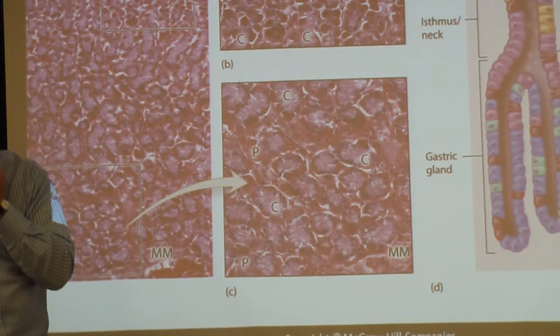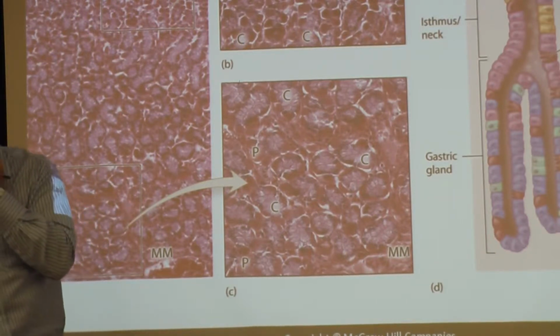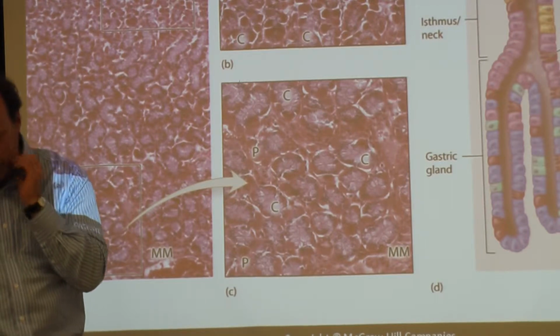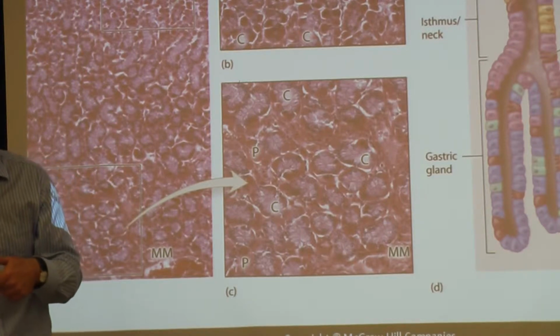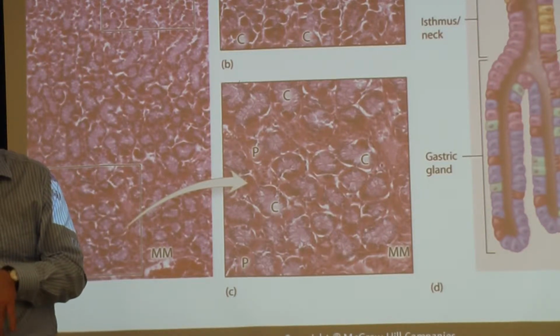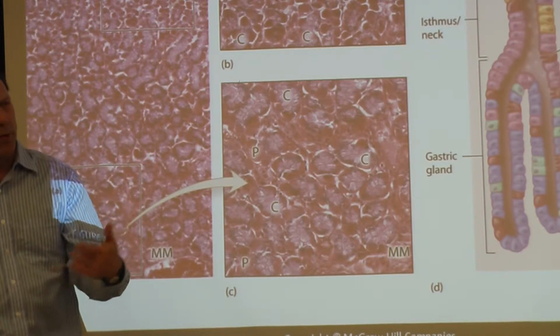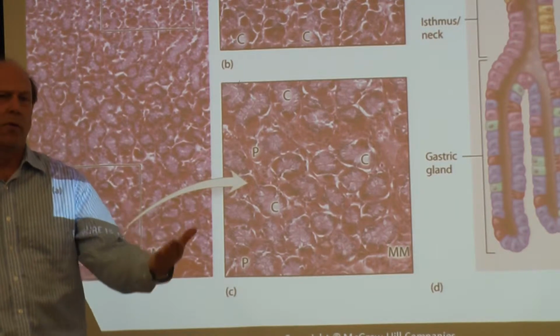There was some discussion on the enterochromaffin cell, and it turns out that the enterochromaffin cell is actually the same as the enteroendocrine cell. It's just if you stain it with a chromic stain, then people that are identifying that stained section would call that an enterochromaffin cell because it was chromate stained.